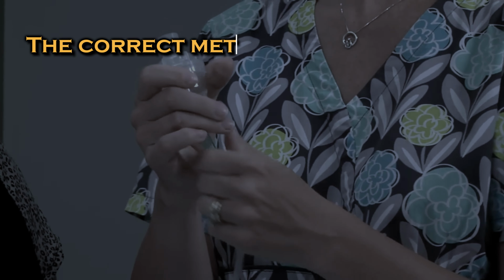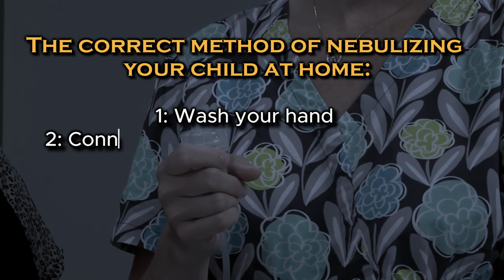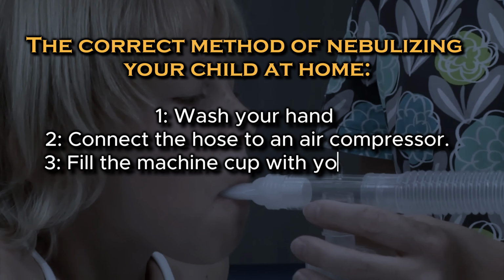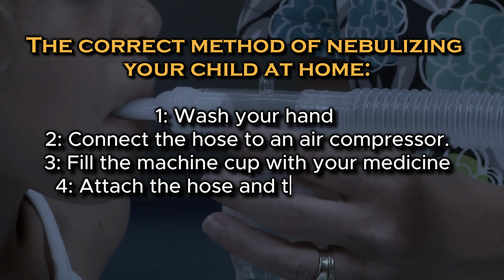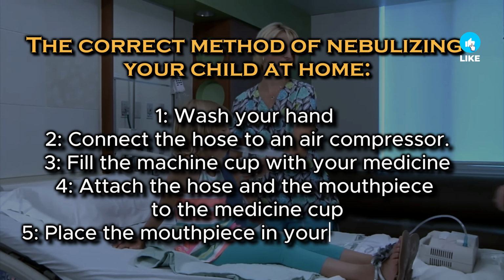The correct method of nebulizing your child at home. 1. Wash your hands. 2. Connect the hose to an air compressor. 3. Fill the machine cup with your medicine. 4. Attach the hose and the mouthpiece to the medicine cup.